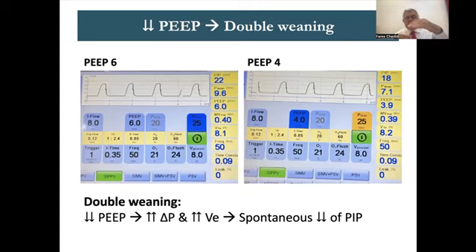We keep the same gradient and we keep the same VE, but that expiratory volume will be produced by less barotrauma and less PIP. That's called dual weaning, weaning the PIP and PEEP at the same time and by the same value to keep the same gradient and same VE at less PIP. But what happens in volume guarantee? Because in volume guarantee, we don't have any say on the PIP. The patient decides his PIP. We decide the VG and the patient decides his PIP.